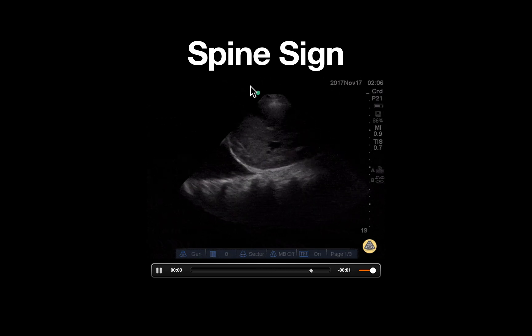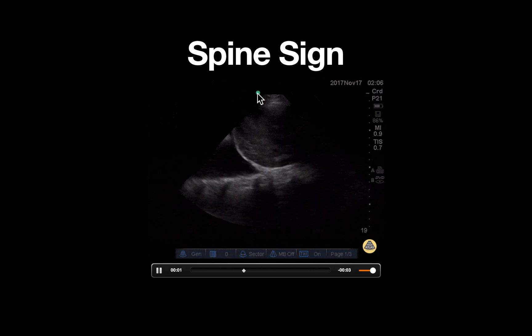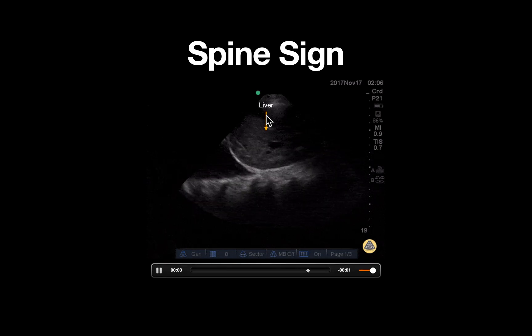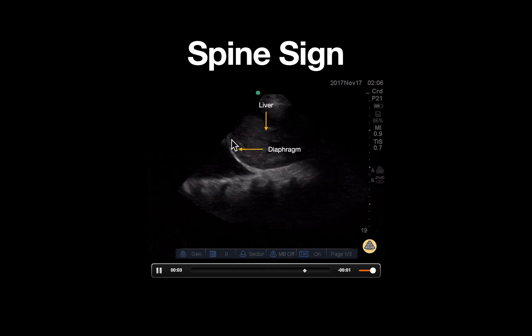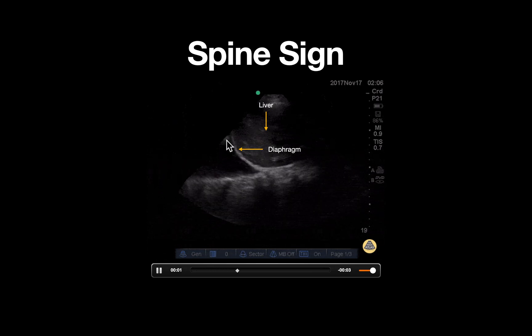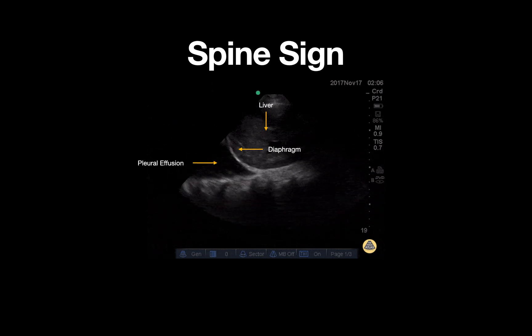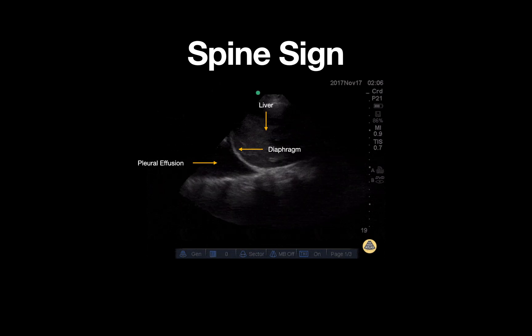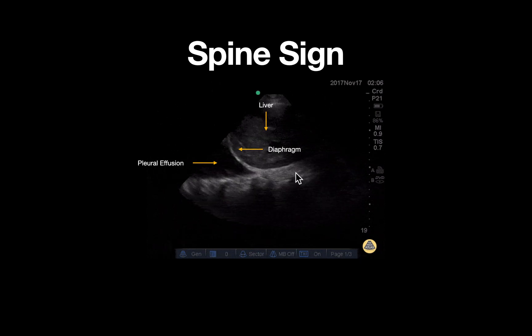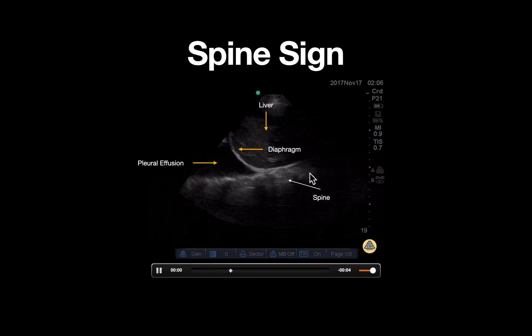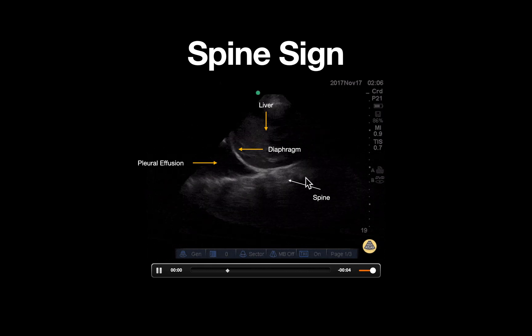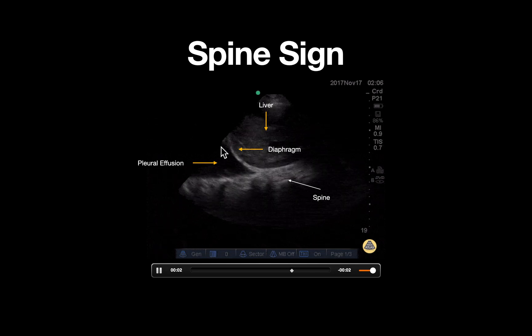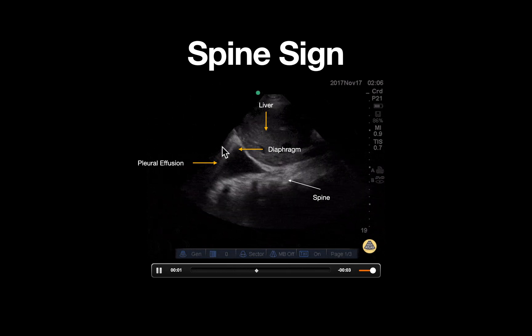Let's look at some important anatomy from superficial to deep. At the top of the screen we can identify our liver, as well as a hyperechoic diaphragm seen here. This anechoic space here is pleural fluid, and the spine is seen in the far field of this image as a hyperechoic longitudinal structure. Lastly, we can see a structure moving in and out of the left side of the screen, which is our lung base.